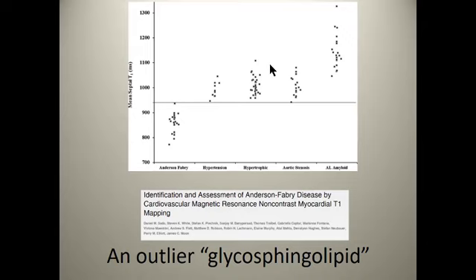So here's another graph from Dan Sado from James Moon's group showing the T1 you get at 1.5 Tesla in different diseases. So in amyloid, the T1 gets very long. In all these hypertrophic conditions, you get an increase in T1 because you're getting more extracellular space.